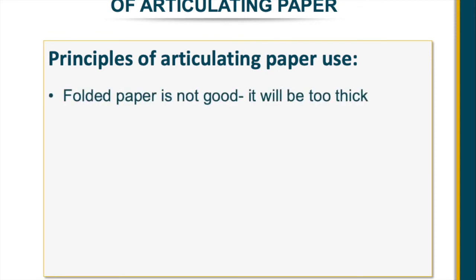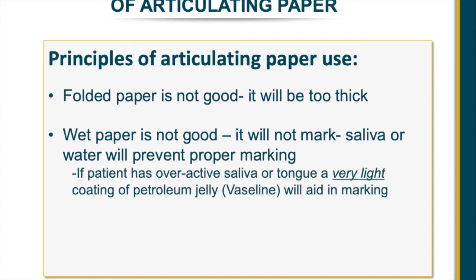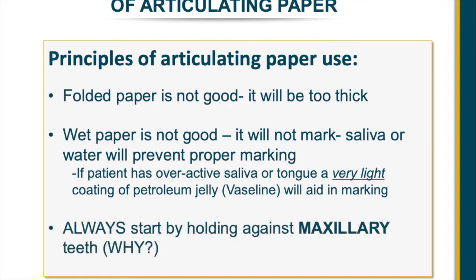So we'll go through a few things here. Folded paper is not good. It makes it too thick because you have a double layer. Wet paper does not generally mark very well, so I recommend that the teeth be dry. If the patient has an overactive saliva or tongue, sometimes using a very light, and I emphasize very light, coating of Vaseline will aid in the marking.